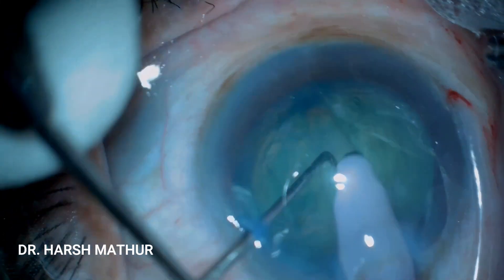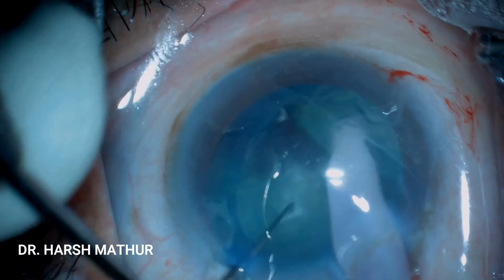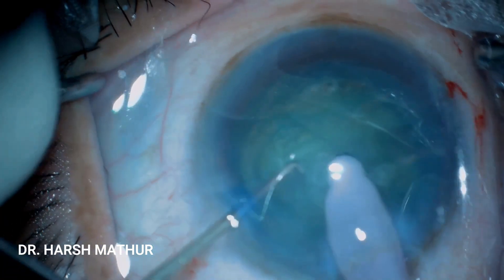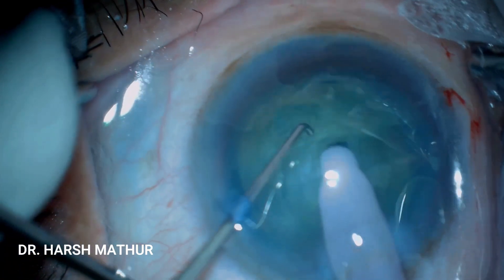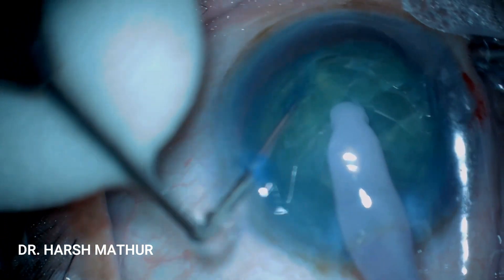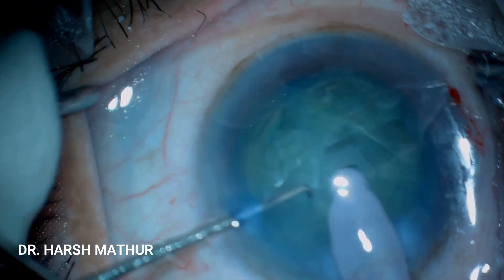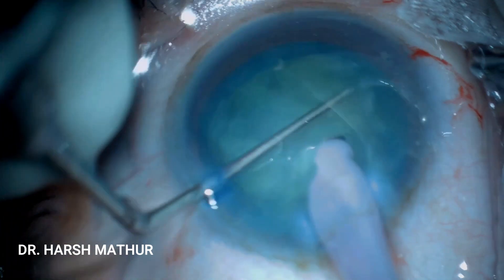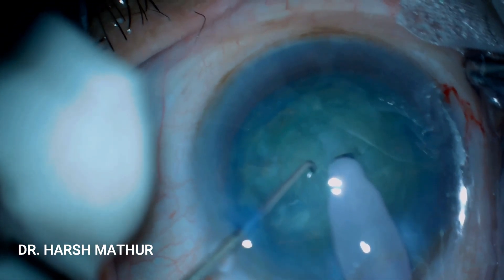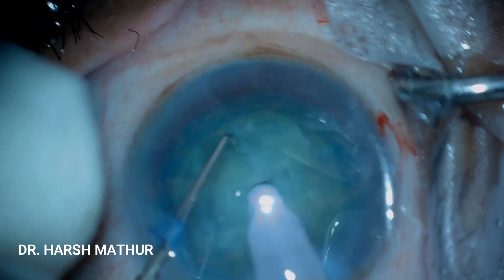Once adequate depth is achieved, the nucleus is separated into two hemi-nuclei. Now each hemi-nucleus is further subdivided into two. The second hemi-nucleus is dealt with next — it is held by the FACO probe and then chopped into two quadrants.